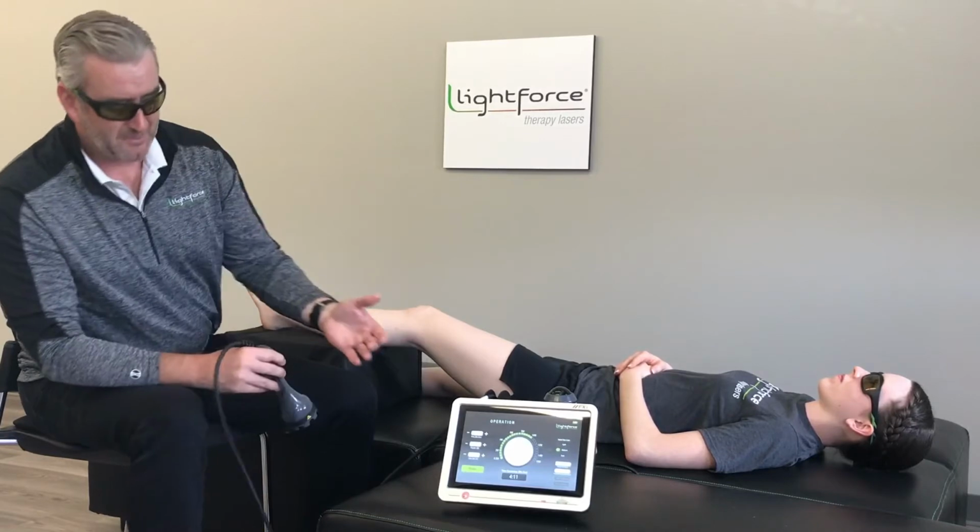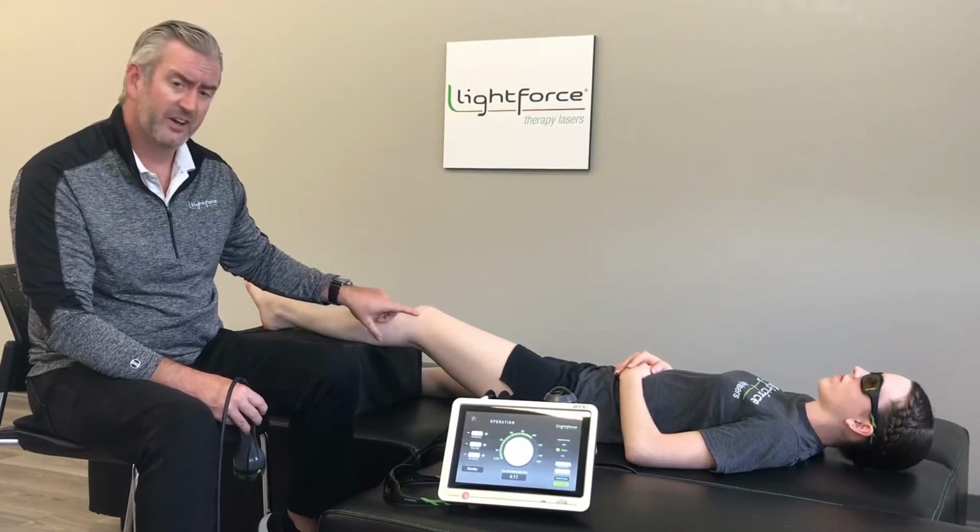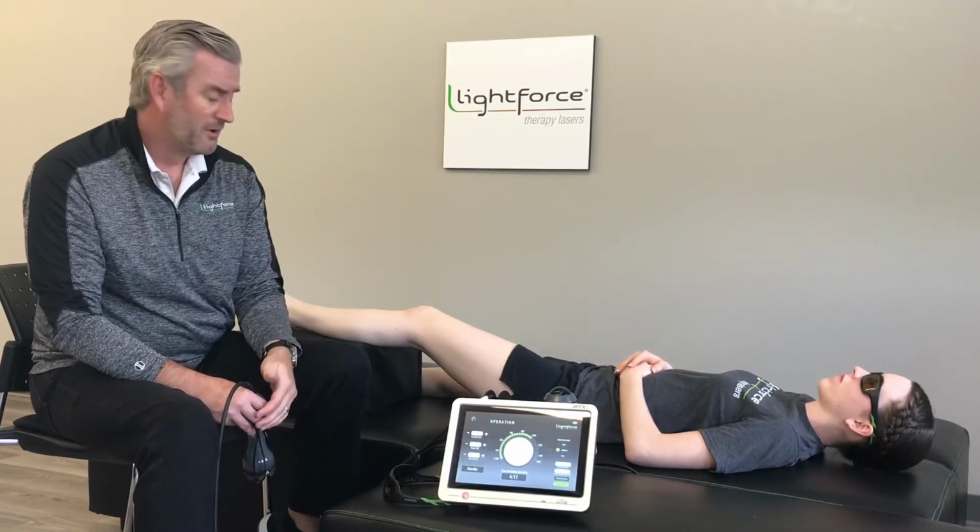We recommend stopping roughly every minute and a half, 2 minutes, checking in with your patient and asking them what their pain level is. How's it feeling? Are things improving? Often they might start to tell you, hey, it was hurting in the front and now it's just sort of hurting in this one area. It allows you as the treater to zero in on that spot and see if you can get that pain to come down even further.